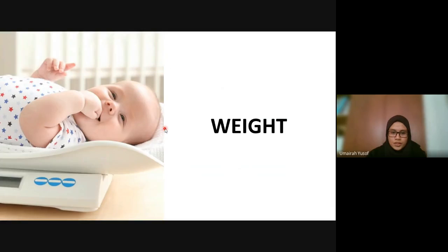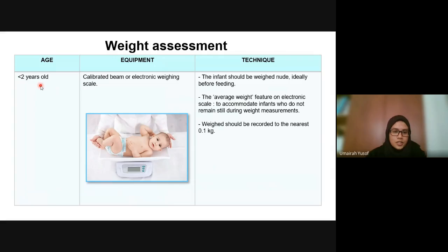So we go to the weight assessment. For infants less than 2 years old, we use the calibrated beam or electronic weighing scale. As for the technique, the infant should be weighed nude, and we also remove the diaper, and ideally we weigh them before feeding. On the electronic scale, we have the average weight feature, to accommodate infants who do not remain still during weight measurements. The weight should be recorded to the nearest 0.1 kilogram.